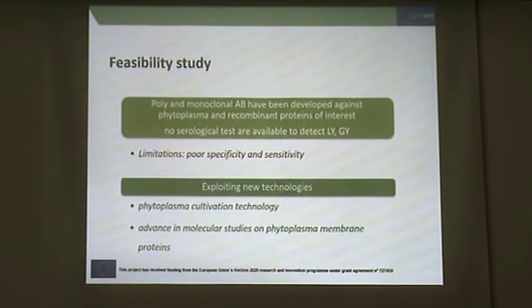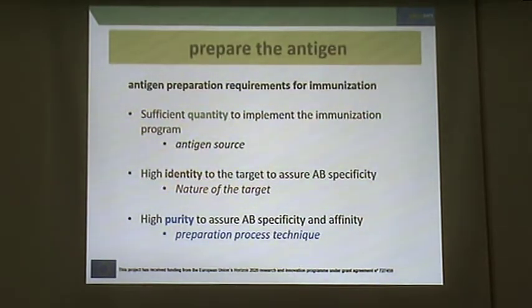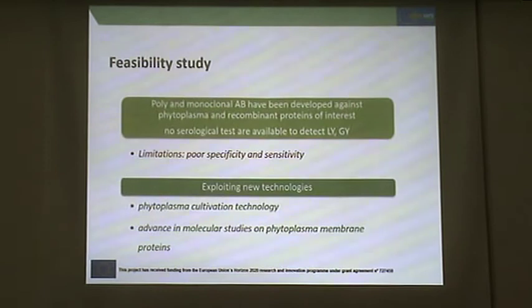I go faster here. We are aware that polyclonal and monoclonal antibodies were developed in the past. However, so far no serological tests are available to detect it due to the poor specificity.